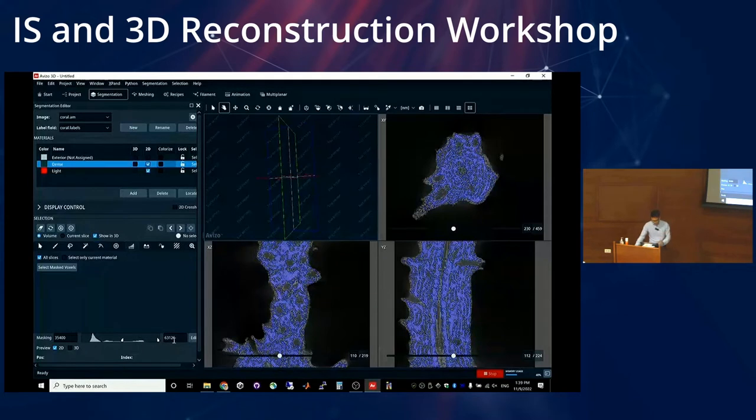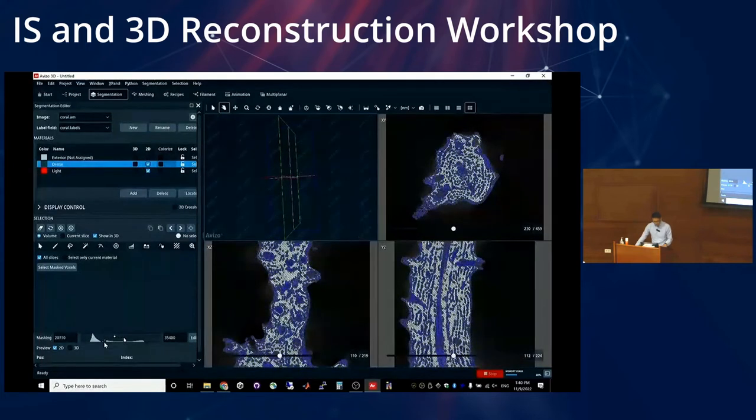And then, as Steve asked before, now I want to select the rest. What I'm going to do is just copy this threshold value here, paste it there, and then adjust. And now here, this is another question: how do you decide on the minimum value here? Well, it's up to you. You are the domain expert. Unfortunately, it's up to you most of the time. So you have to decide what's the proper value to use here.